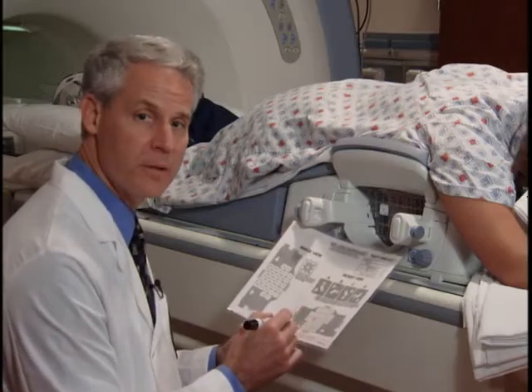fiducial marker. Having placed your fiducial on the grid and obtained your initial sagittal localizer scan, initially navigate till you find your fiducial, and then move to the slice section that demonstrates the skin surface. At this point, place a cursor on the fiducial and record the slice depth.